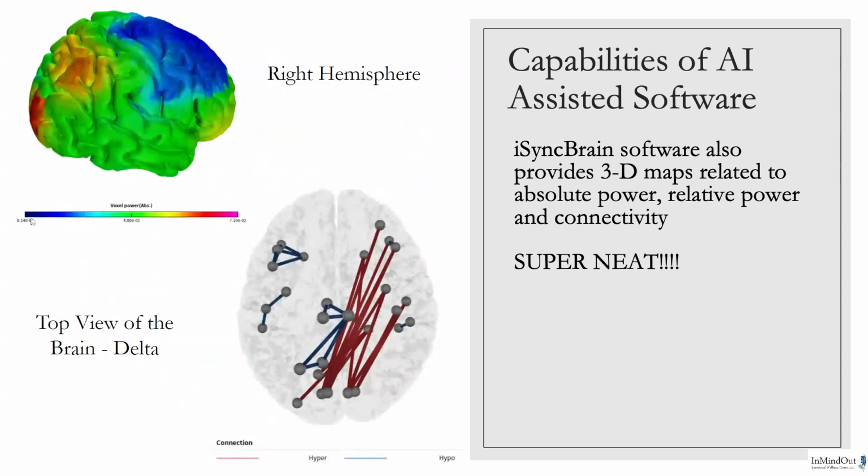And again, this is an individual brain map where we see the person's electrical activity going on just based on looking at, for instance, a certain wave bin or frequency bin. It doesn't say here what frequency bin it is, but let's say this is also delta.